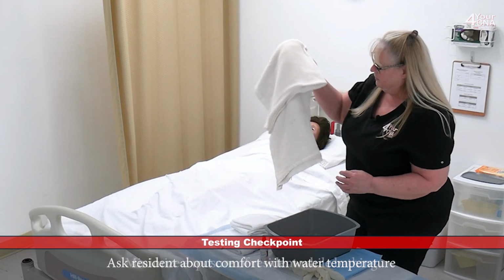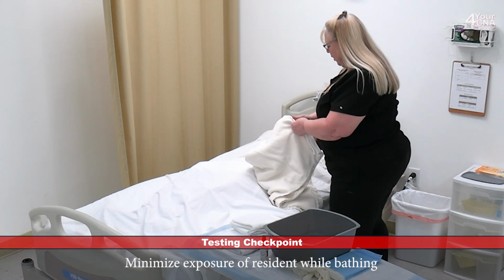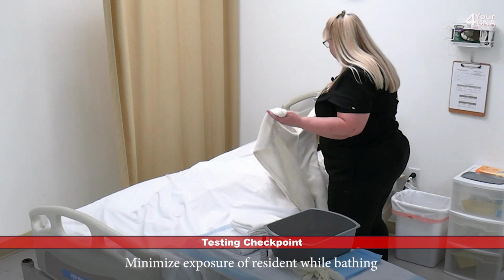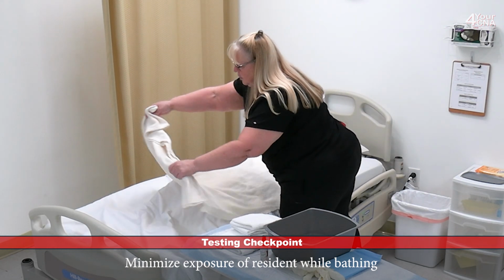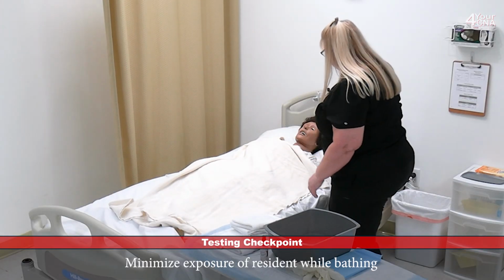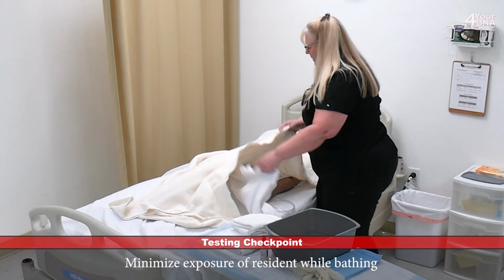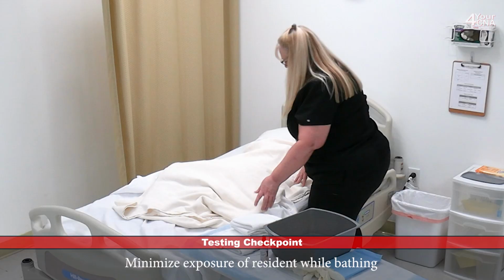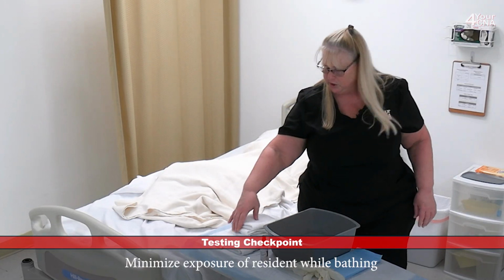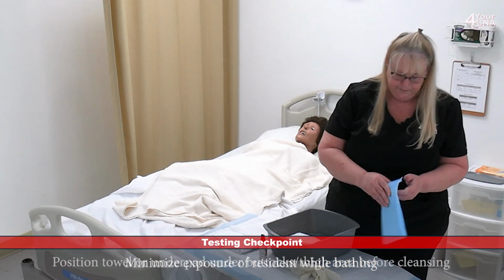Okay. I'm going to place this privacy blanket over you, and this is going to help keep you warm and provide privacy as we do this skill. So I'll lay the privacy blanket over the sheet without snapping it or shaking it, and then pull the sheet down to about your waist. I'll put the washcloths in the basin. That way they get warm.